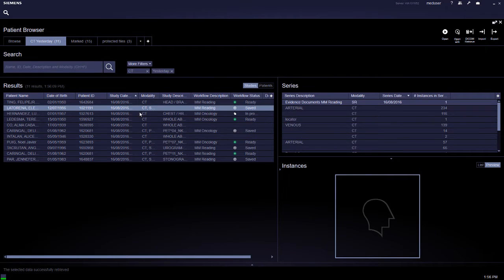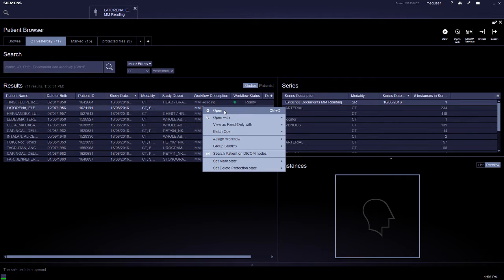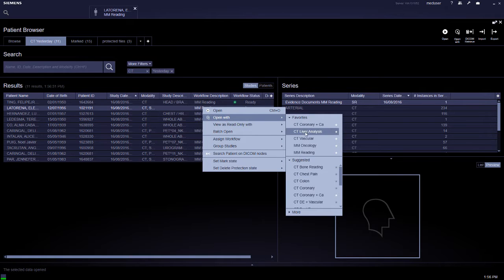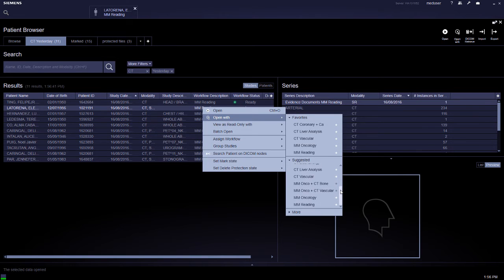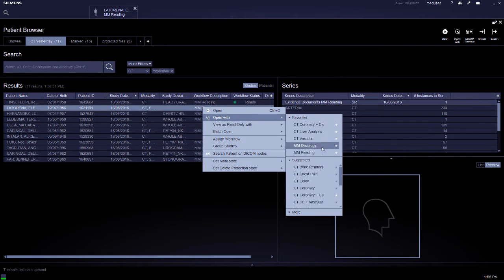Now we'll go through the MN reading. There are various ways to load cases. If the case already has a workflow attached, you can double-click, or right-click to open, or open with a different workflow if needed. Workflows can be set as favorites by clicking the star on the side, which allows quick access to the most used workflows.